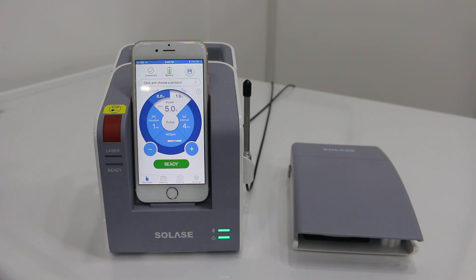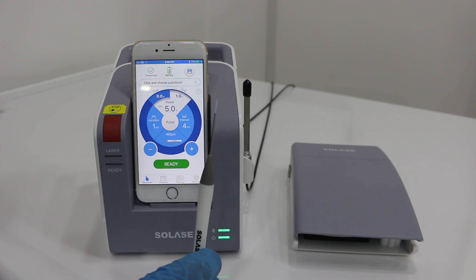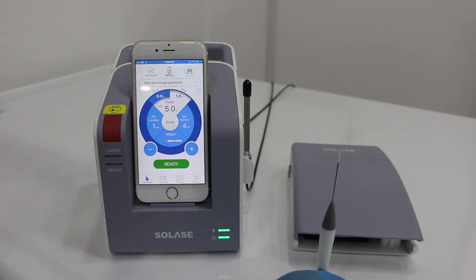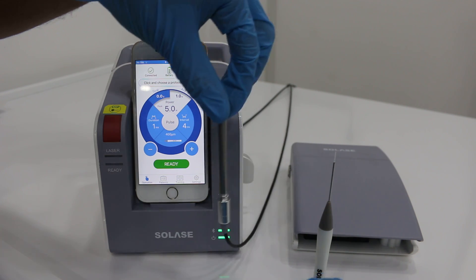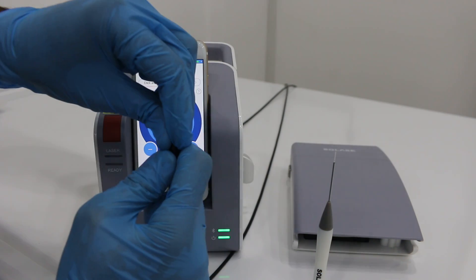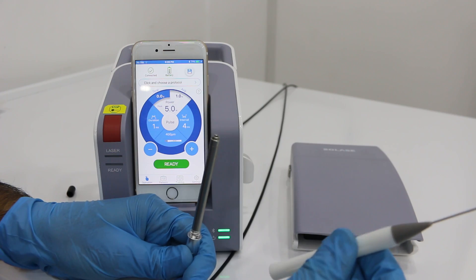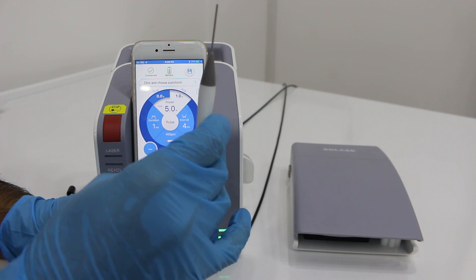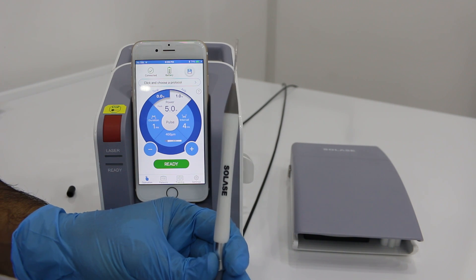Now we are going to install the tip into the fiber. The tip is autoclavable up to five times. To install it on the device, take the fiber from the holder, remove the cap, and then place the tip into the fiber and screw it tightly. And now it's on.